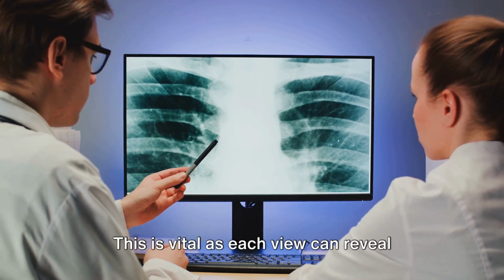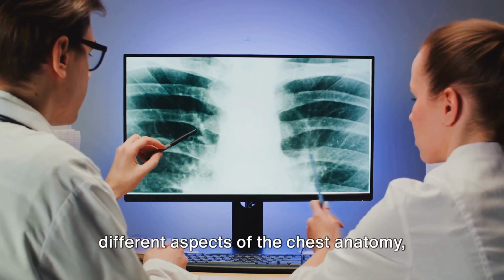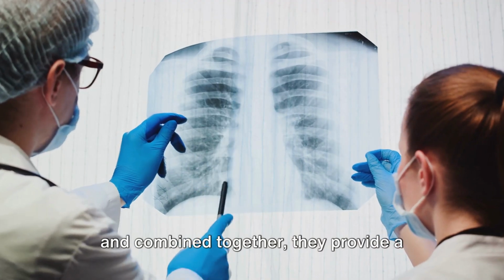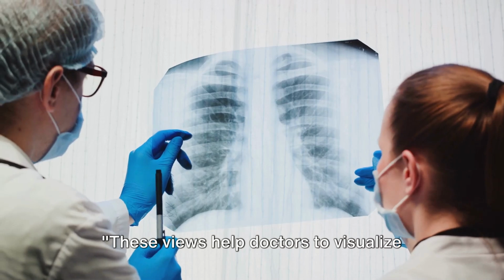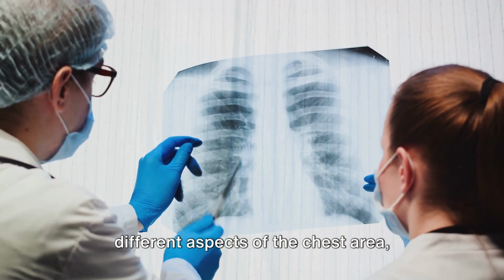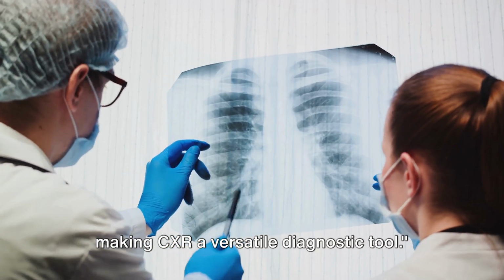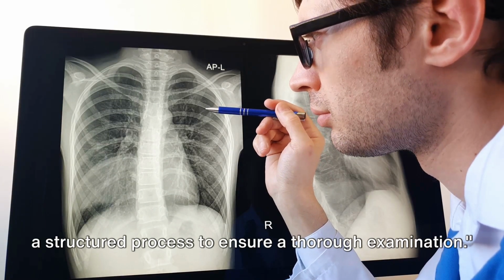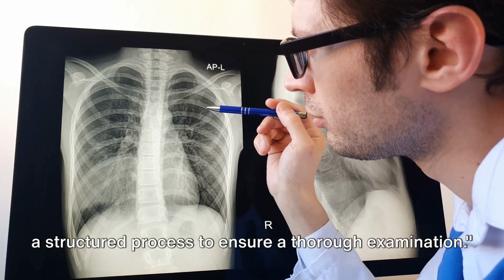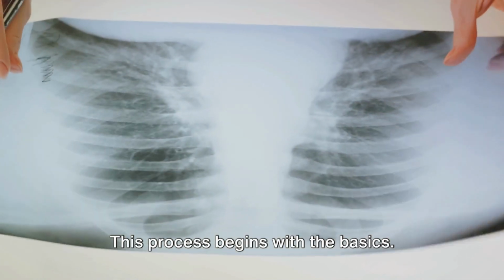This is vital as each view can reveal different aspects of the chest anatomy, and combined together they provide a thorough examination of the thoracic area. These views help doctors to visualize different aspects of the chest area, making CXR a versatile diagnostic tool. When doctors approach a CXR, they follow a structured process to ensure a thorough examination. This process begins with the basics.